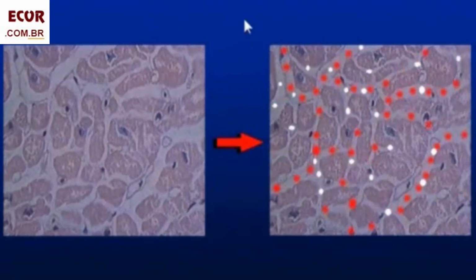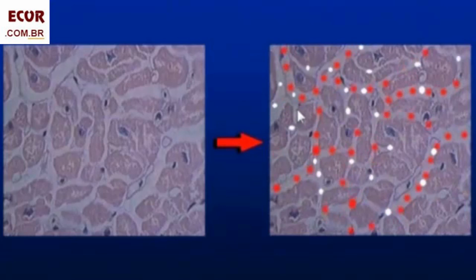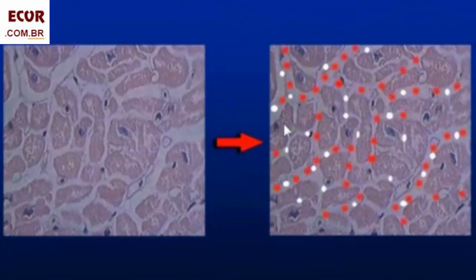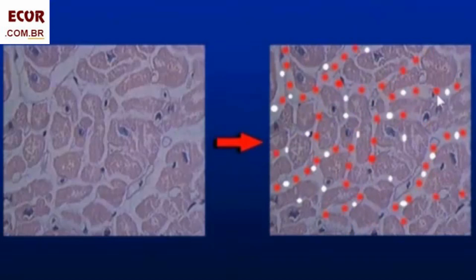The best method to analyze myocardial viability is studying myocardial perfusion with microbubbles. We have the largest experience with this method using our protocol with Adenosine Bolus, IV bolus. This protocol will be shown on a later talk. For now, suffice to say that Adenosine Bolus produces an important arteriolar dilation with enhancement of perfusion at the normal myocardium and a decreased perfusion at the ischemic myocardium due to coronary steal.